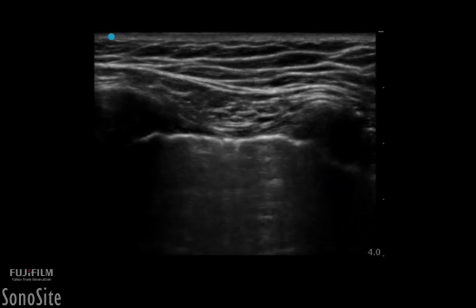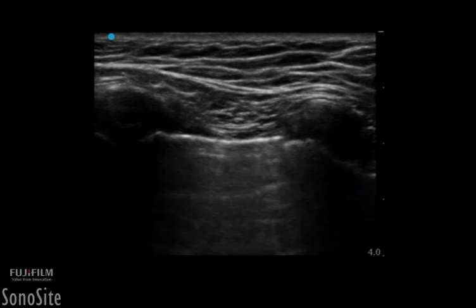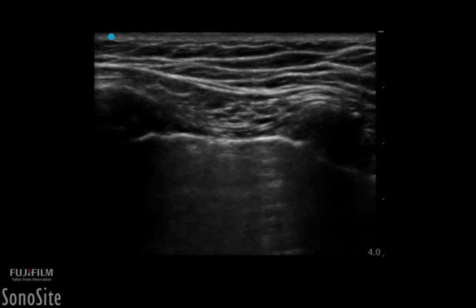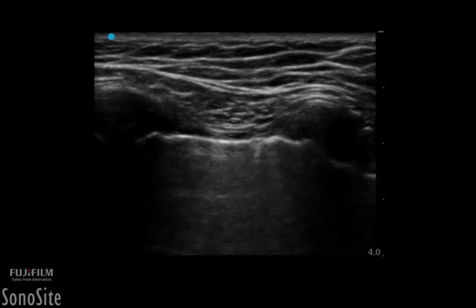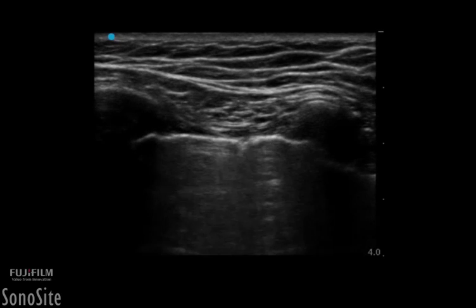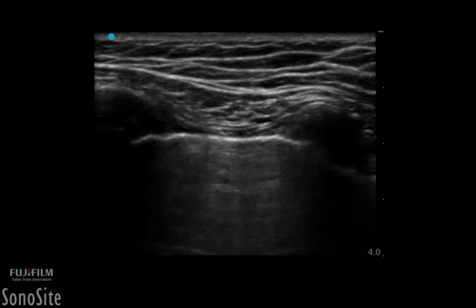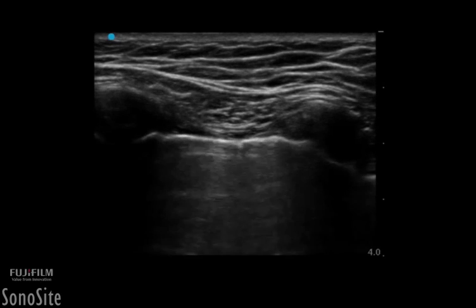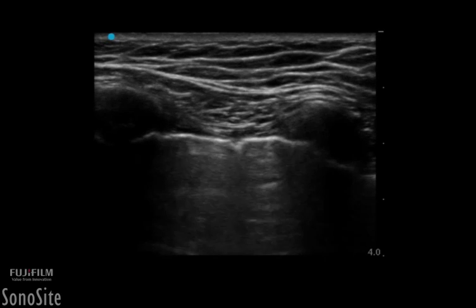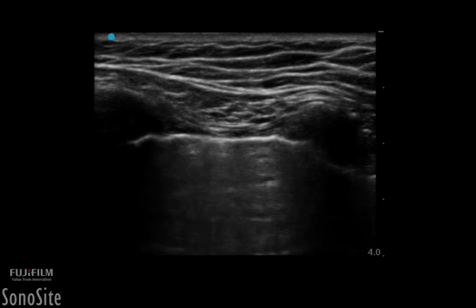The utility of ultrasound to detect the presence of a pneumothorax is useful as this is a commonly known complication of various invasive procedures. To assess for a pneumothorax, one is evaluating for the presence of lung sliding. This phenomenon relates to the sliding motion that occurs when the visceral and parietal pleura slide across each other during the respiratory cycle. The presence of lung sliding suggests appropriate lung expansion, and thus, absence of lung sliding suggests that the visceral and parietal pleura are not in contact with each other.